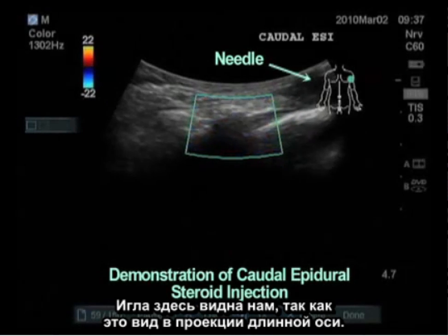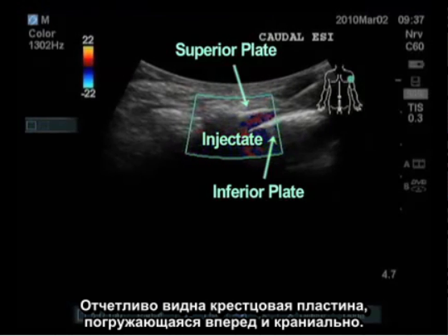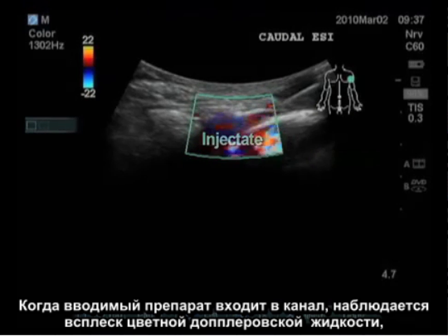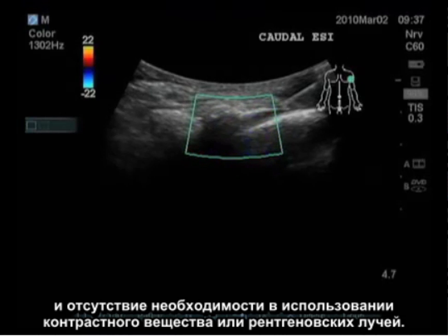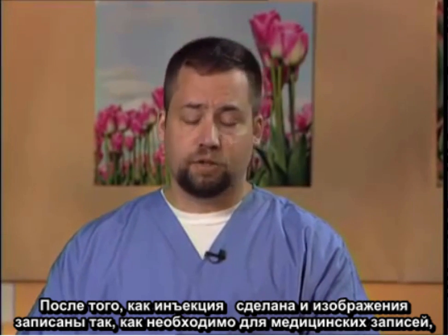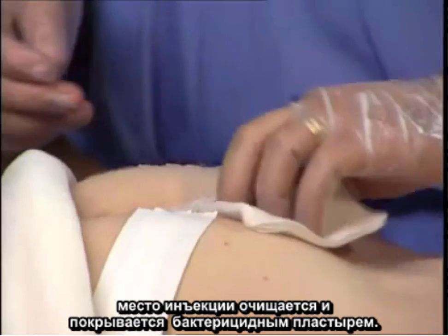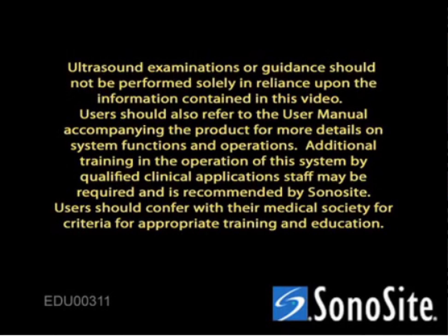The needle is visible as this view is in the long axis. The sacral plate is clearly visible, diving anterior and cephalad. Once the injectate enters the canal, the color Doppler shows the fluid perturbation confined within the sacral epidural space, indicating a successful injection without need for contrast or x-ray.